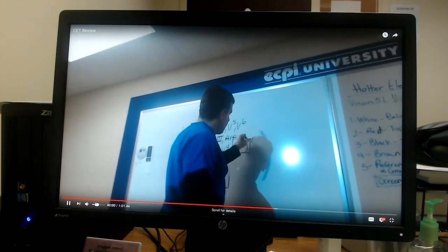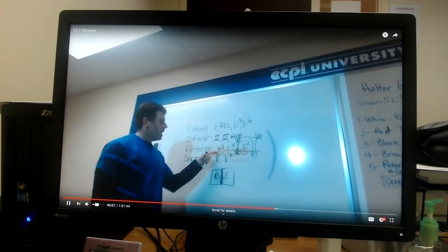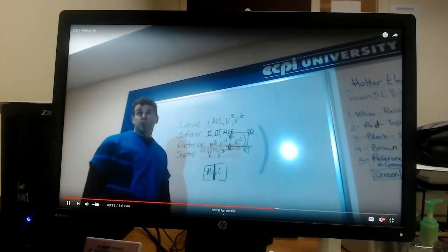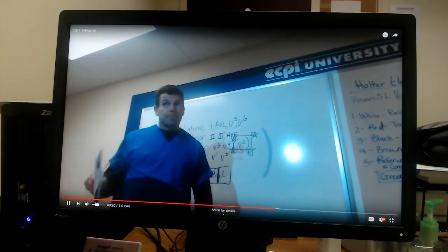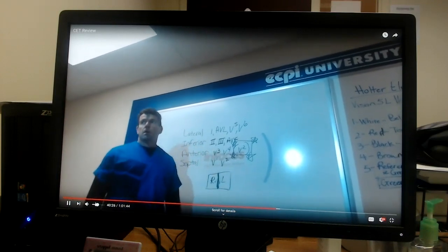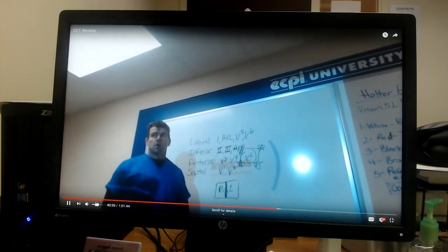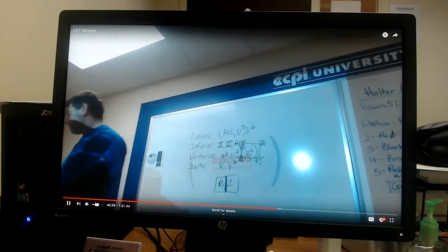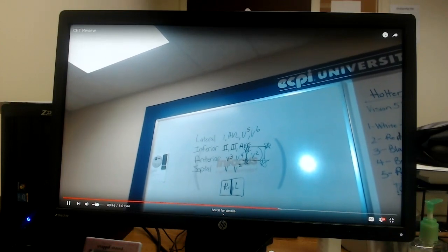I would say that this is kind of the exception and those are the rules. Because to me, V1 and V2 are septal just because of the location. But I did extra research, and in some cases, they might consider V2 an anterior view of the heart, not just viewing septal. But again, that would be the exception, not the rule. So it's going to be D.